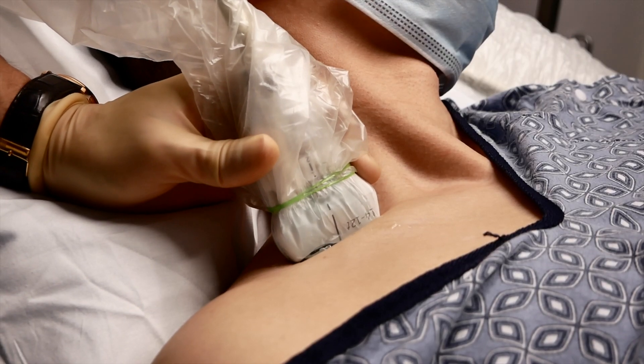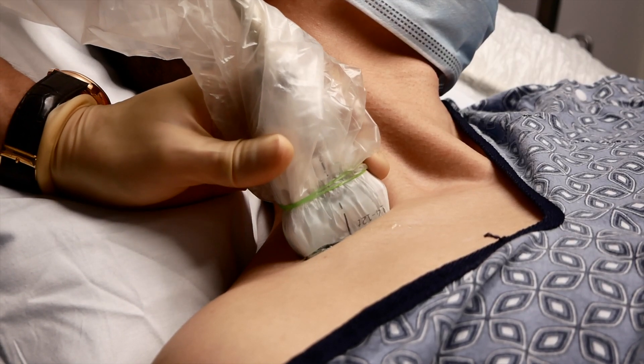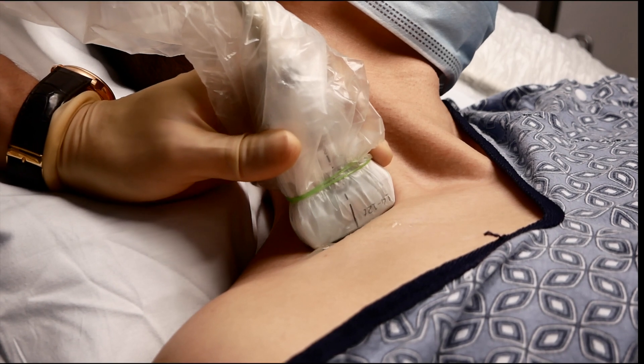The patient is positioned supine with the head turned opposite from the block site. Scanning begins with a transducer oriented transverse on the neck and superior to the clavicle at the midpoint.